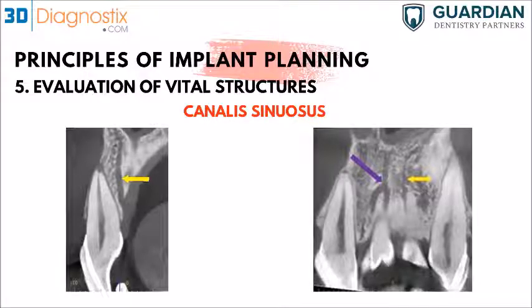Sometimes it's misdiagnosed as a blood vessel or the nasopalatine canal. With the experience, of course, of planning and looking at hundreds of thousands of scans, we would know the difference between a blood vessel and a canalis sinuosus. So this is one of the things we usually look for and try to avoid.